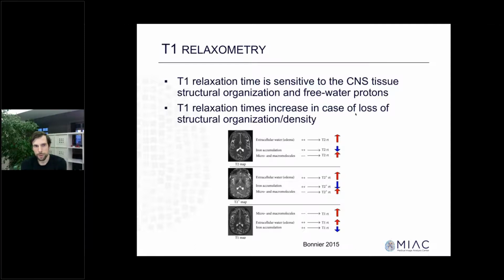Now let's focus on T1 relaxometry. T1 relaxation time is sensitive to the CNS tissue structural organization and free water protons, and the T1 relaxation time increases in case of loss of structural organization of the tissue and density.